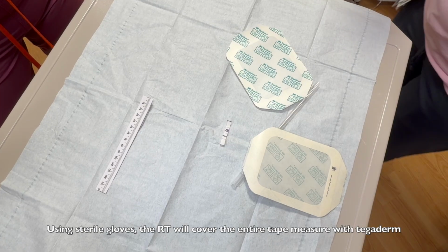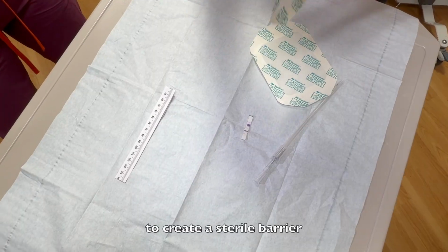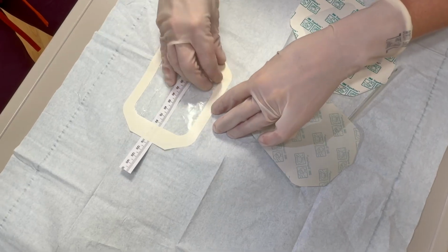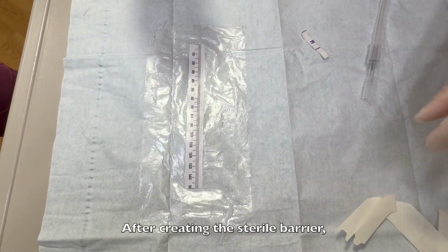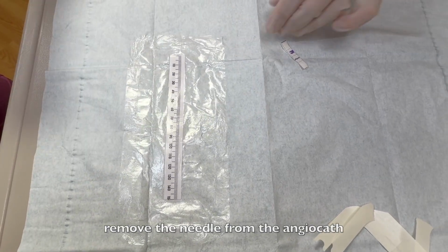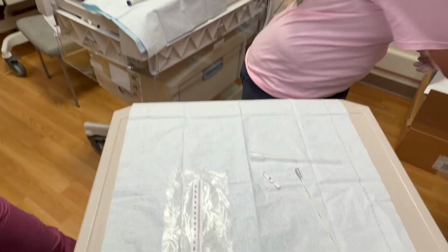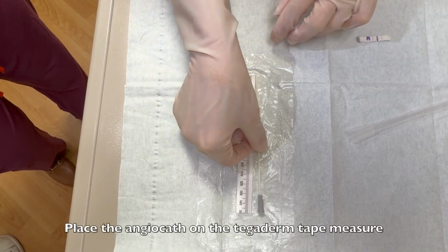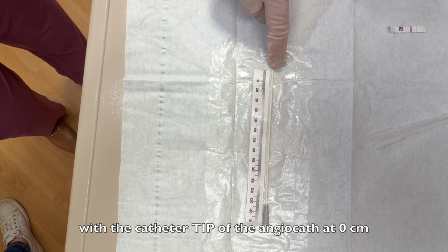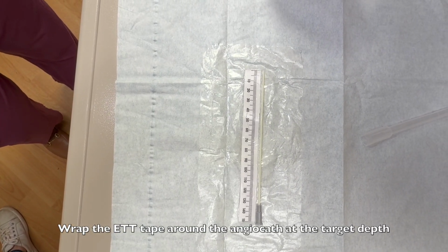Using sterile gloves, the RT will cover the entire tape measure with tegaderm to create a sterile barrier. After creating the sterile barrier, remove the needle from the angiocath and throw it away. Place the angiocath on the tegaderm tape measure with the catheter tip of the angiocath at 0 cms. Wrap the ET tube tape around the angiocath at the target depth.